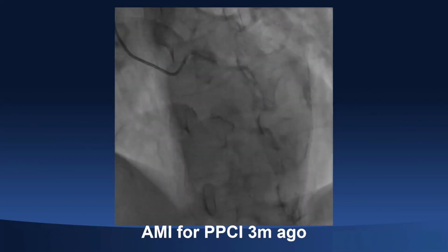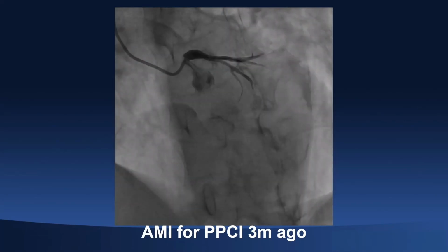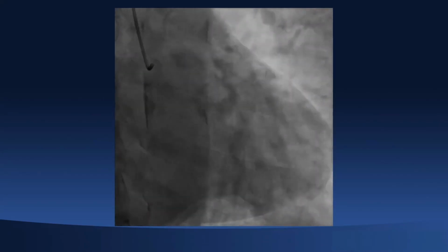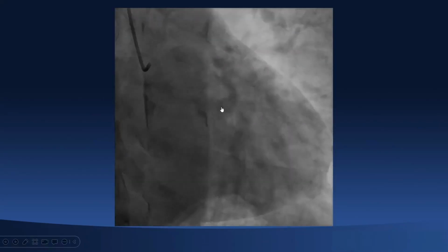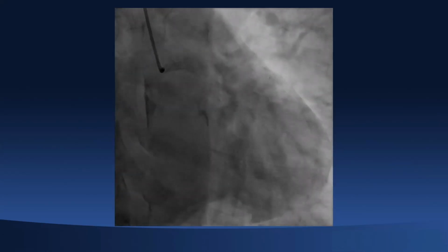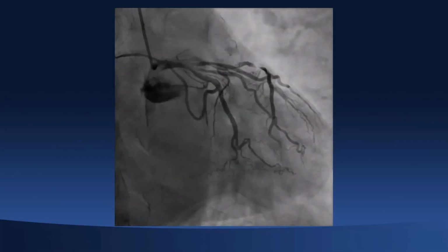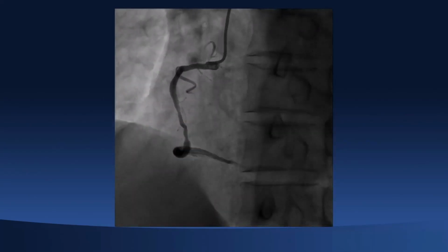We can see the calcified lesion in the left main and 80% stenosis in the proximal to middle LAD, with the LAD fourth diagonal branch being a true bifurcation lesion, and a relatively normal LCX, with 60% stenosis in OM and 70% stenosis in proximal to middle RCA, with severe calcification.